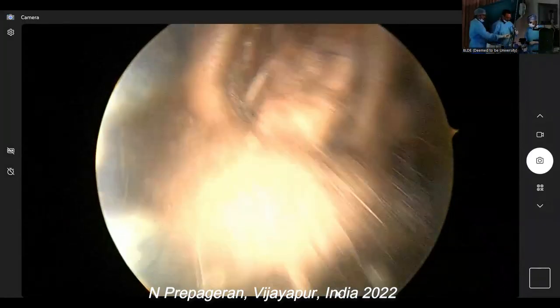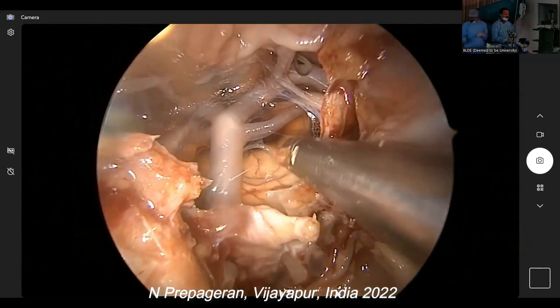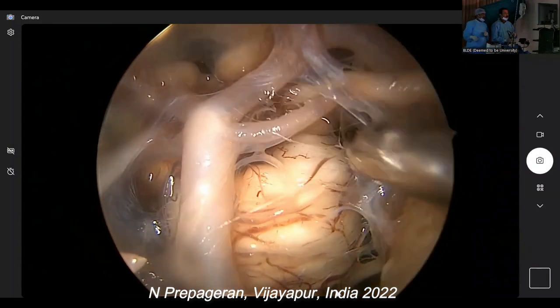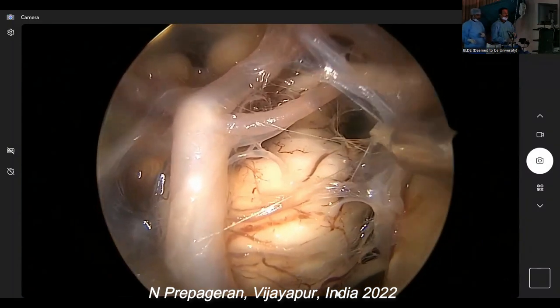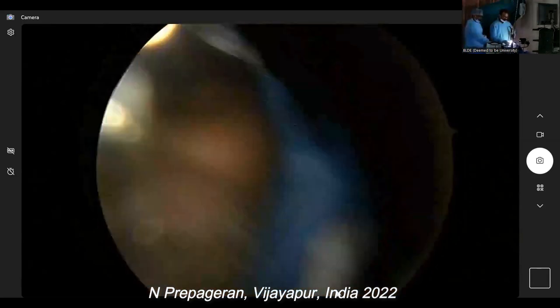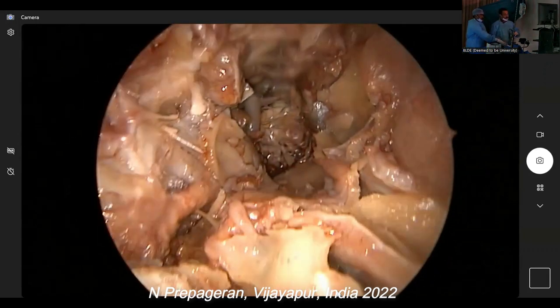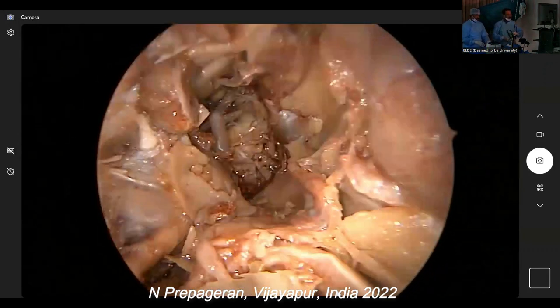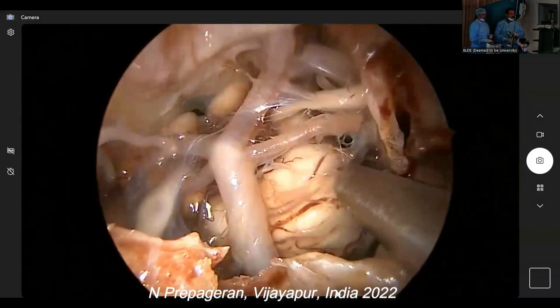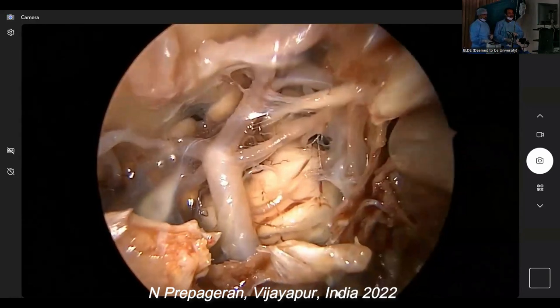We need a 30-degree scope after this. Let me remove all the liquid. I can see the fifth nerve coming into view. Punch again. Let us enlarge the opening a little bit more. Sideways. Only the dura. Bite only the dura.